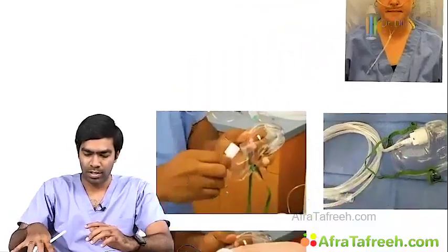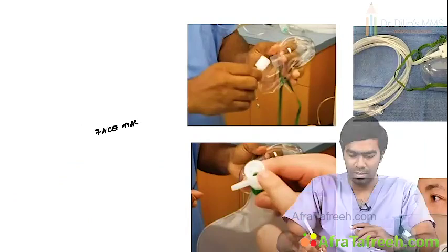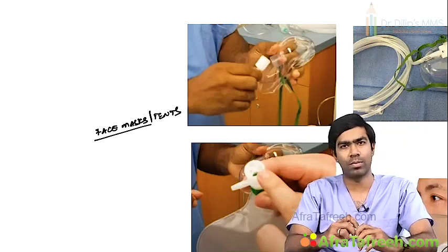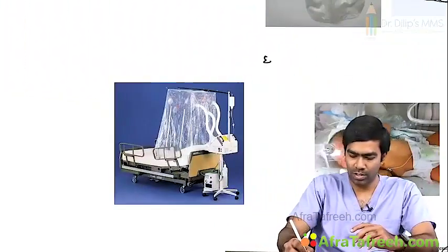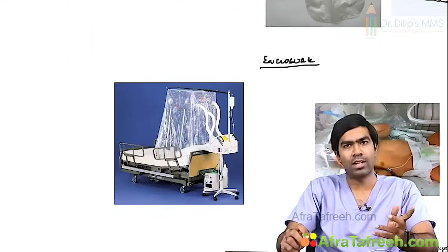Second one is the nasal cannula system, which you can see very commonly in the hospital. Third one is the face mask system. Face masks and face tents. Face tents are very rare, but face masks are very common. Different types of face masks are there, which we are going to discuss. Next, we have enclosure systems, where we have oxygen tent and oxygen hood.